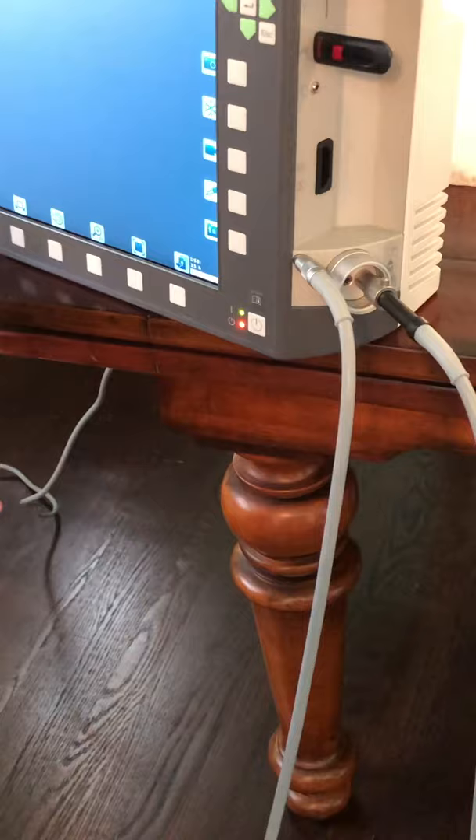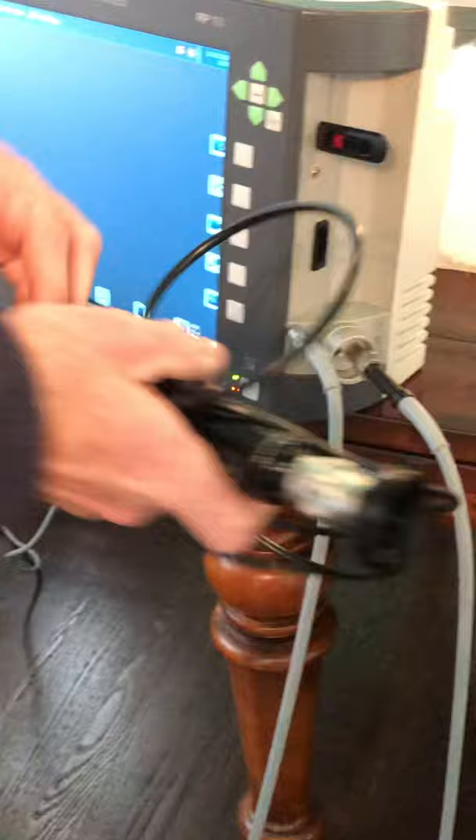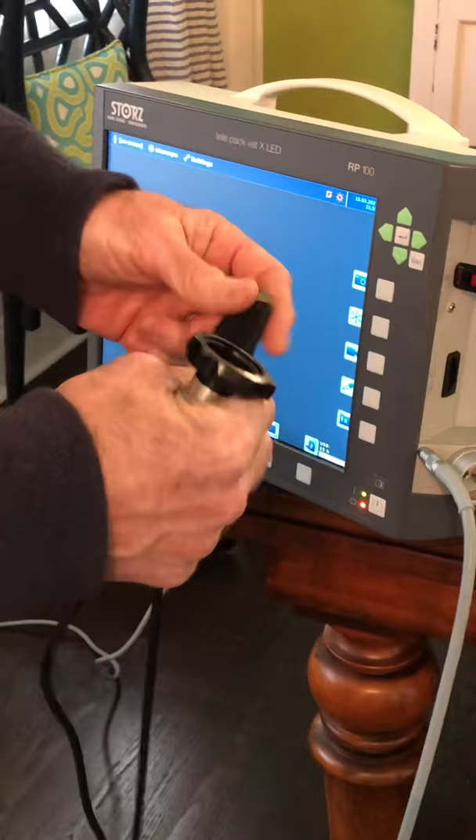The next thing you'll need is the camera head. The camera head has a card edge on it, and you're going to plug that card edge right into that port right there.